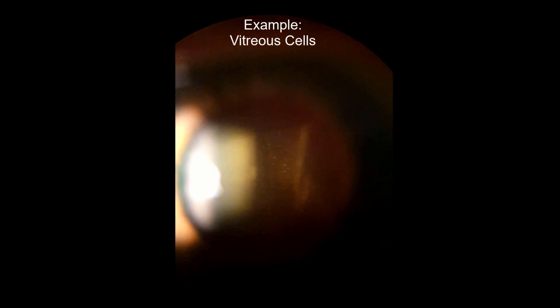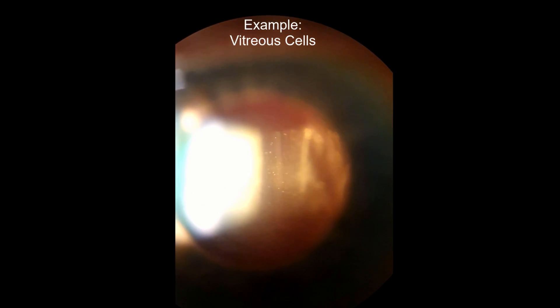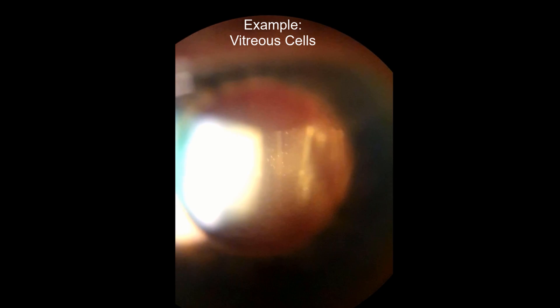You can use this method with slight adjustments to see other structures by dynamically moving the illumination arm angle. If you shorten the height of the beam and use about a 45 degree angle, you can examine the anterior chamber. You can also focus further back into the vitreous to look for cells or tobacco dust.